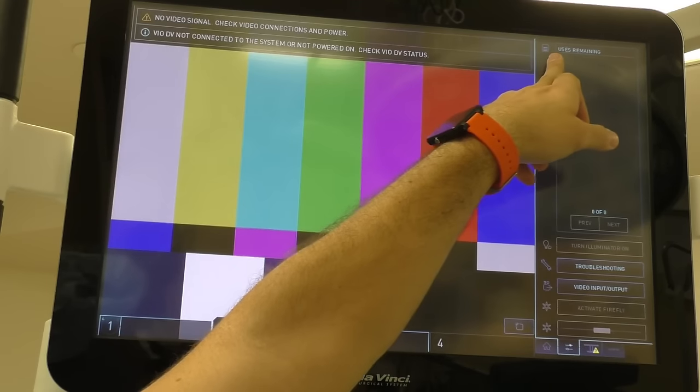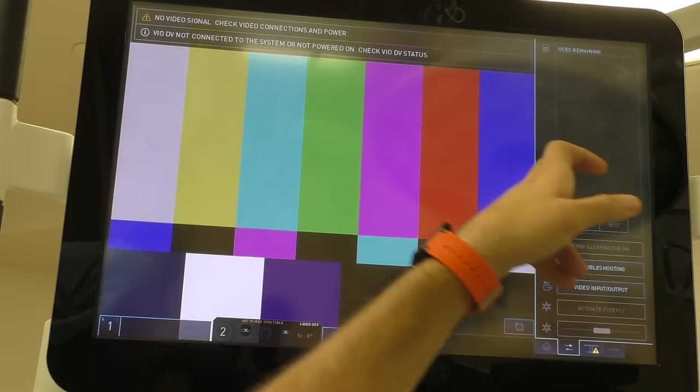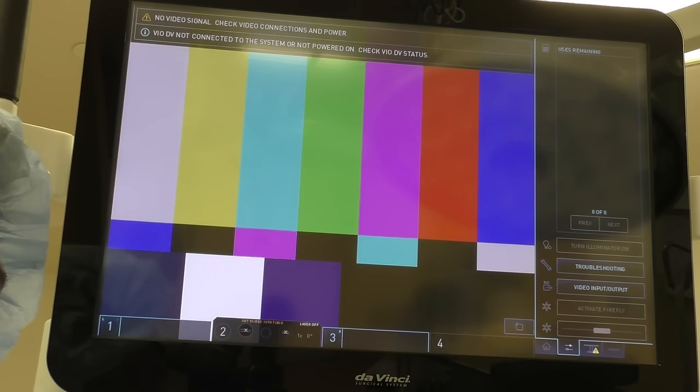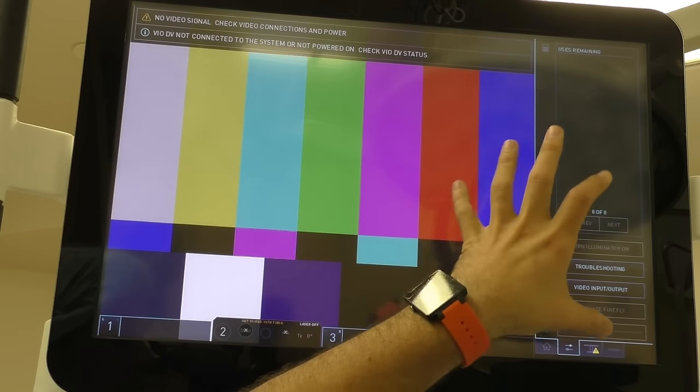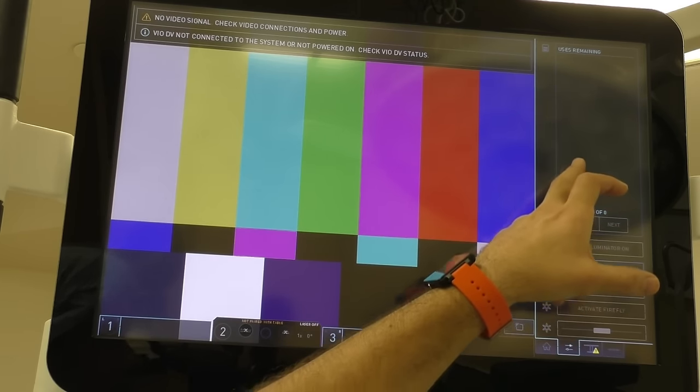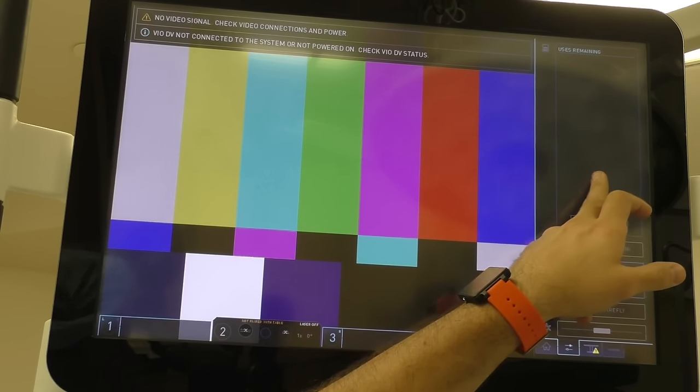Up here it says 'uses remaining' — what's important about this is that all of the instruments we use in a robotic case have lives. They have a certain number of uses per instrument — it could be 15, it could be 20, it could be 50 depending on what the instrument is. What's great about this monitor is that you'll be able to look this up at the end of the case.